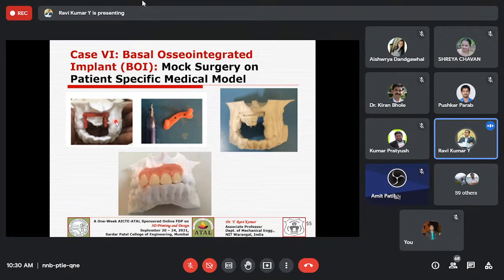Even further, we initially printed a model, not exactly the implant. The implant will be printed in metal, titanium 64, and initially we printed with a polymer-based desktop printer. This is for checking the fitment of the implant against the patient's bone, and they can practice the fixation on these models, and ultimately it is left with the four teeth.